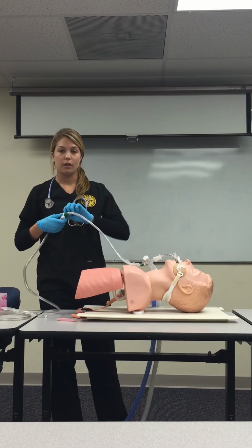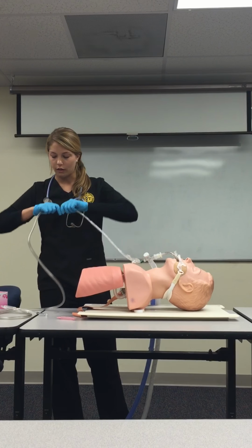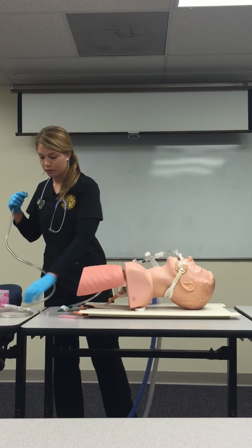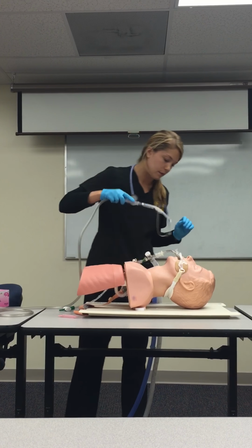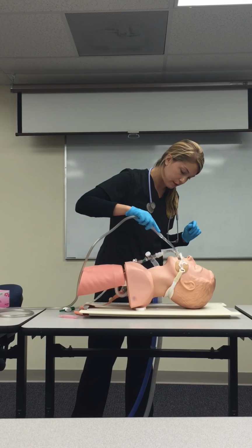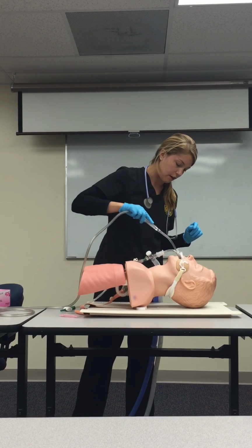I'm going to lock my thumb port, make sure that nothing happens with that. And then I'm going to go ahead and suction him in his mouth with the Yankauer. Mr. Doe, I'm going to suction your mouth. Get all the secretions out of there.